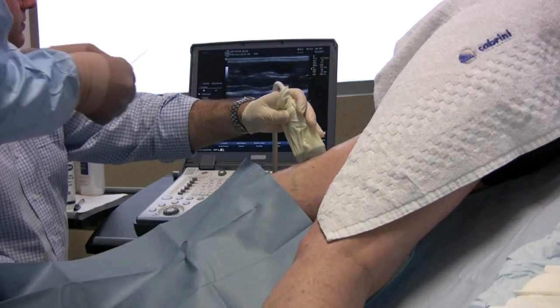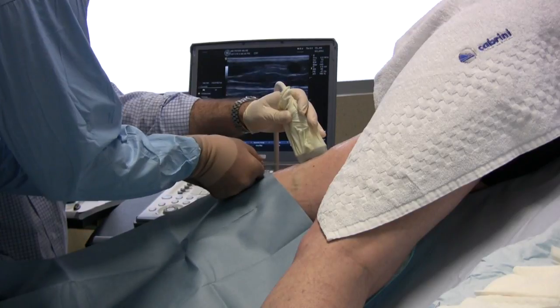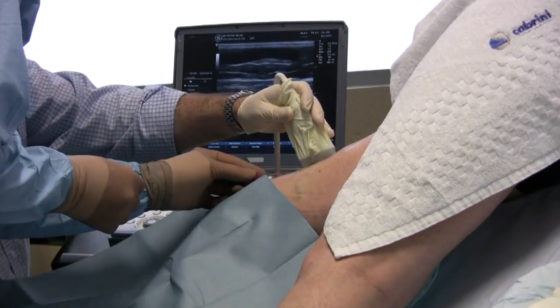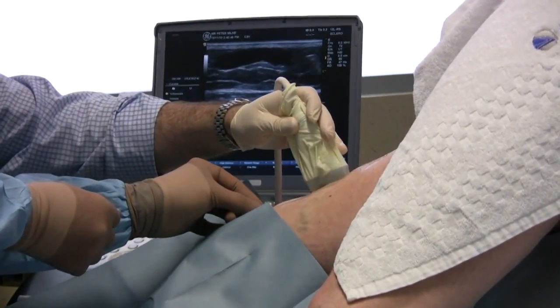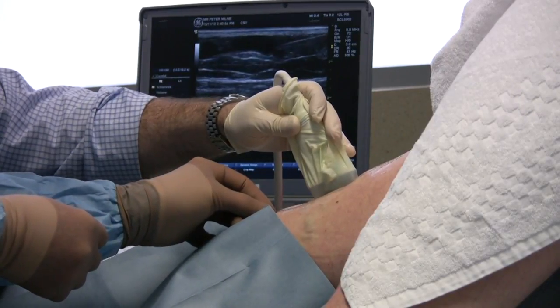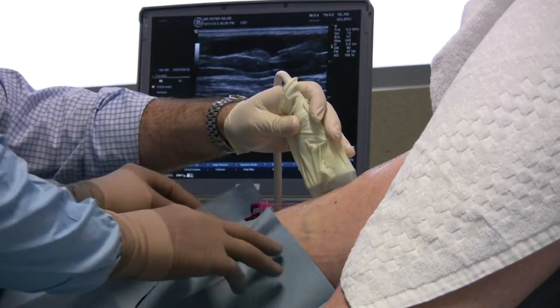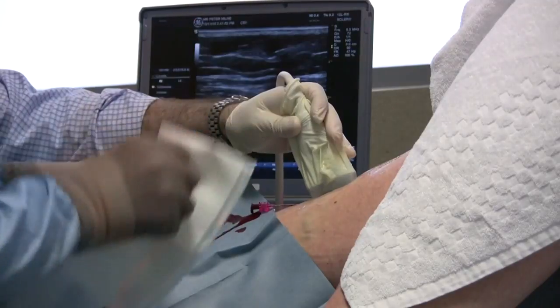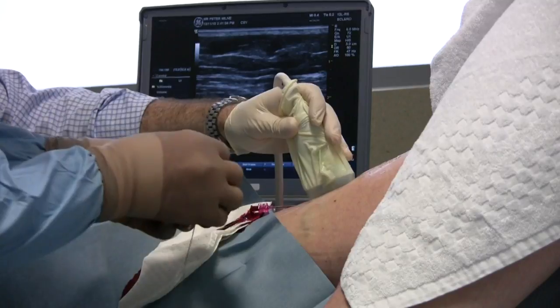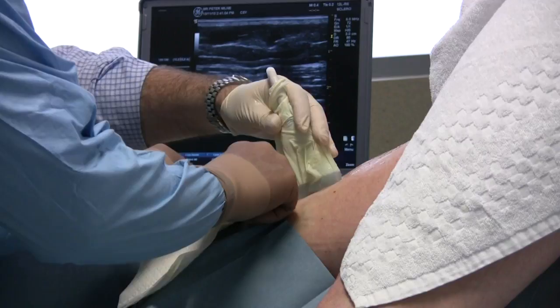The access needle is then introduced through the area that has been anaesthetised, and confirmation of the access occurs when blood comes back through the needle itself. This is followed by introduction of a guiding wire which will stabilize the access point so that a sheath can be introduced.